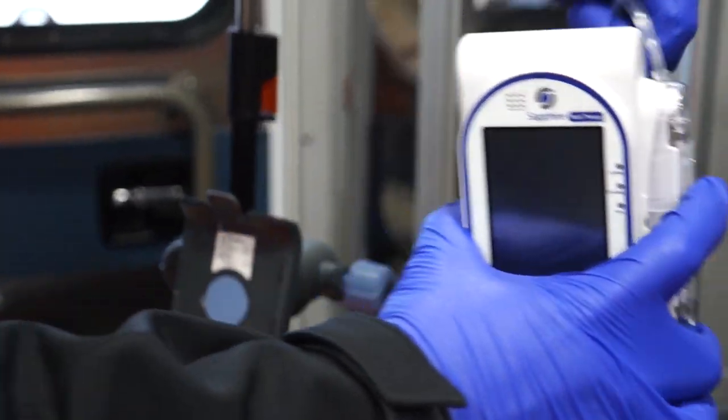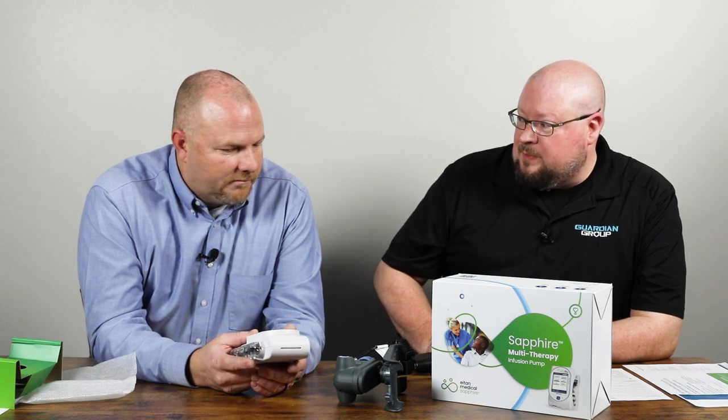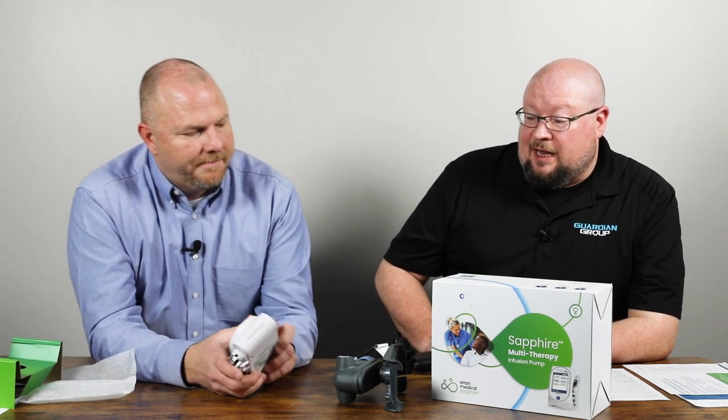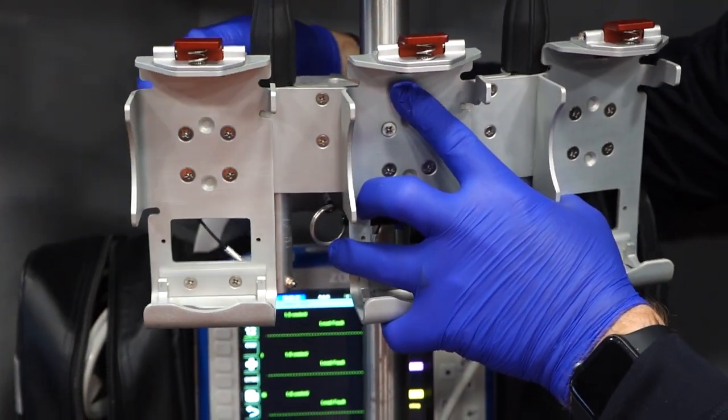This pump is the only pump on the market — as far as a new pump — that is rated for both ground and air transport, which is a huge thing today. It's important to know that this is not only a single-channel pump but also a multi-therapy pump. It's got a PCA lockbox that you can get as an option. You can run piggybacks through it, epidurals — the sky's really the limit. The portability allows for multiple pumps to be placed together; there are optional mounts where you can put up to three pumps side by side.